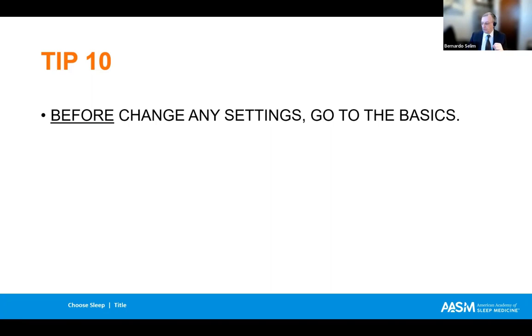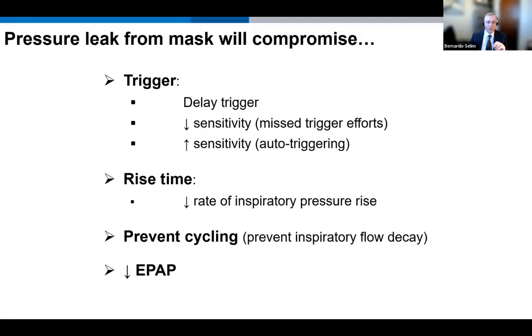Tip 10, and the last one, and I know that I wanted to give you time to answer questions. Before changing any settings, I repeat, before changing any settings, go to the basics. Never leave the basics. And the basics is what is happening to the interface. I always say, this is your Achilles tendon. Everything that you do, how fancy you get with your settings, it doesn't matter, because everything is going to go through the window if you're leaking pressure through your mask. Your trigger, your rise time, your EPAP, your treatment, your pressure support delivery, everything is just messed up.